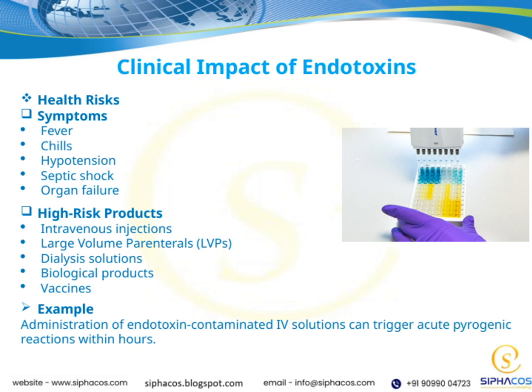For example, if an IV solution is contaminated with endotoxins, it can cause a sudden and intense fever reaction within just a few hours. Understanding these risks helps us prioritize safety in critical treatments.